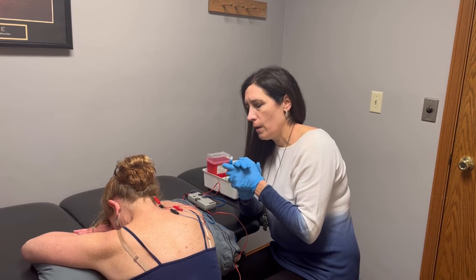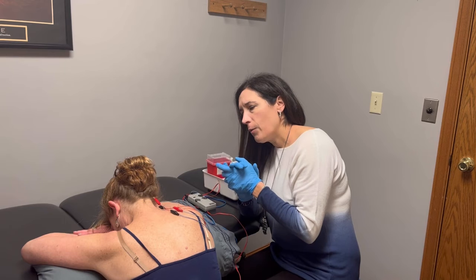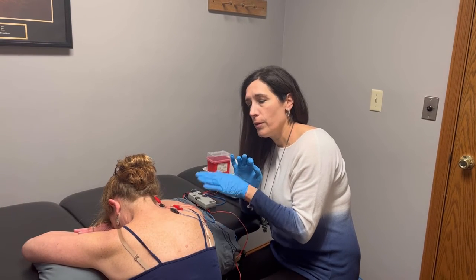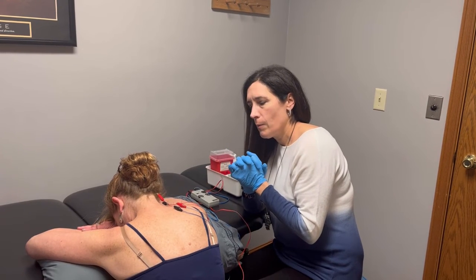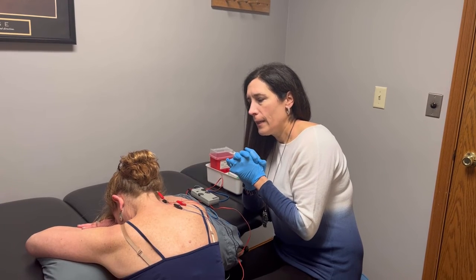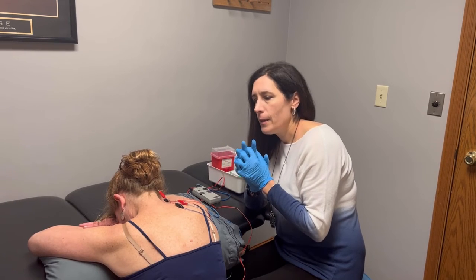To accelerate this process a bit, we have her hooked up to some electrical stimulation. It just makes it a little more intense, really stimulates the muscle and the soft tissue a little bit more to help with the pain and the healing process. Usually this process takes maybe 10 minutes.